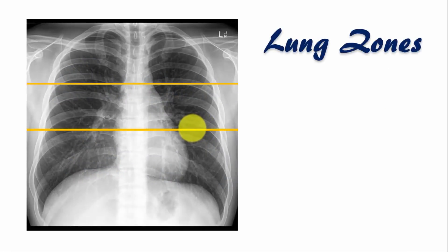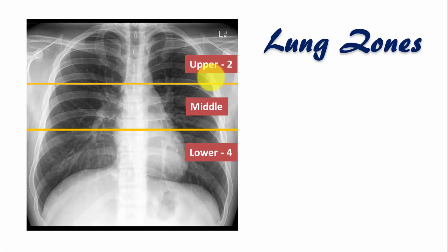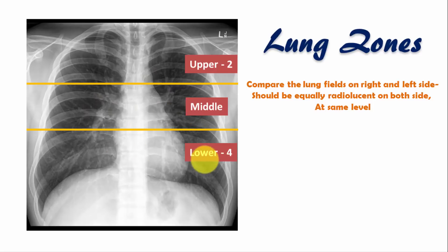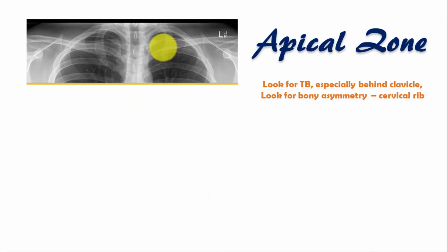Now let's inspect the lung fields. Divide the lung fields into three zones: upper, middle, and lower. The upper zone is the area above the anterior ends of the second rib, the lower zone is below the anterior ends of the fourth rib, and the middle zone is between the anterior ends of the second and fourth ribs. Compare the lung fields on the left and right side and comment on radiolucency — normally it should be equal on both sides at the same level. In the apical region, look for initial signs of tuberculosis, especially behind the clavicles, and check for any cervical rib or bony asymmetry.